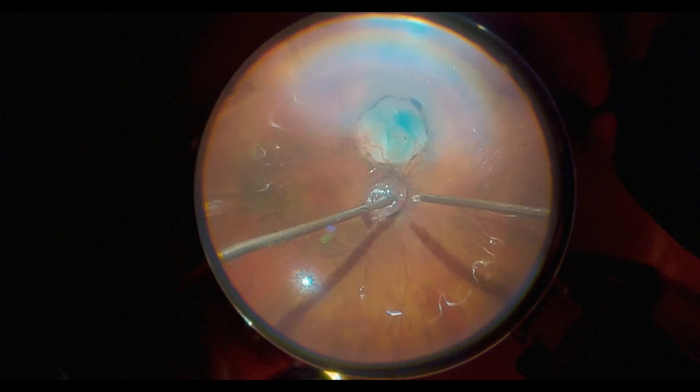This requires the area to be very, very dry. You put the tissue glue in, then put an activator in. The patient did very well.